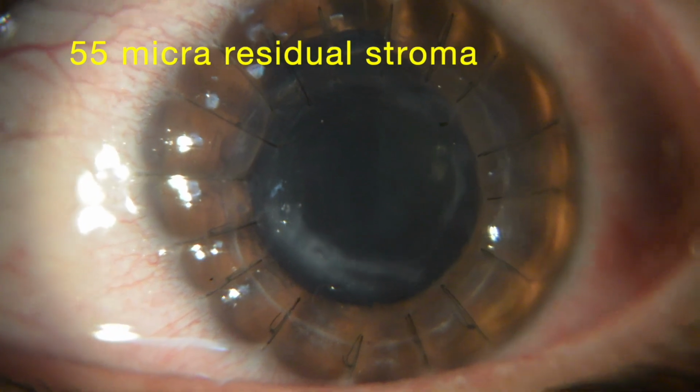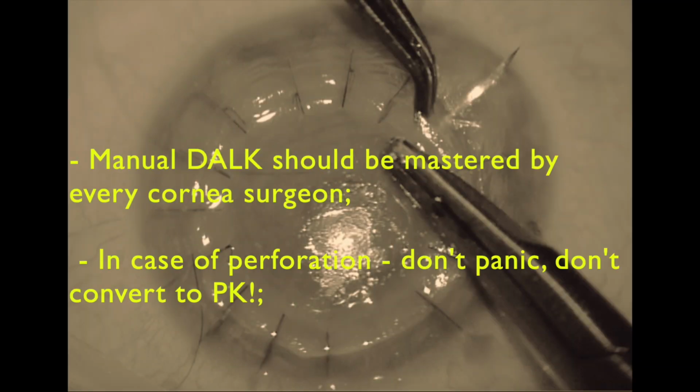(55 micro-residual stroma). Manual DALK should be mastered by every cornea surgeon. In case of perforation, don't panic, don't convert to penetrating keratoplasty.